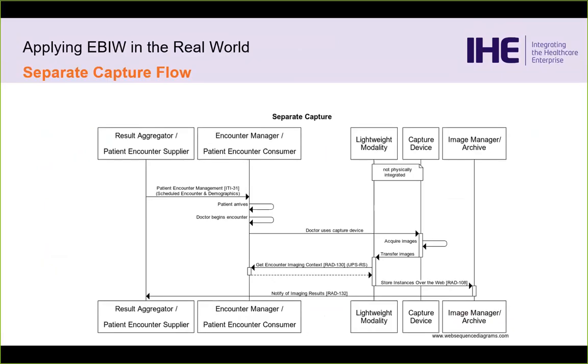So I won't go through a lot of the details. All of this is in the documents. There's another webinar that Sim put together that you can go hunt up, which goes into a few more of the technical details. Just wanted to highlight here, for example, that in terms of workflow, it's not necessary that the query come before the image capture.